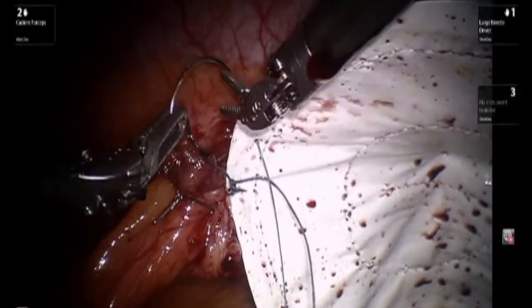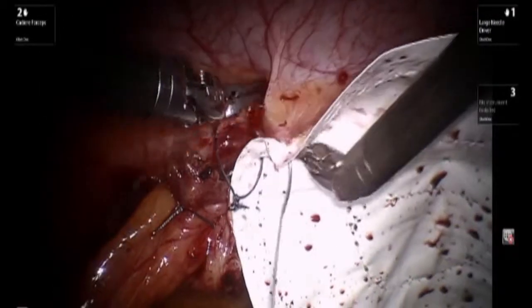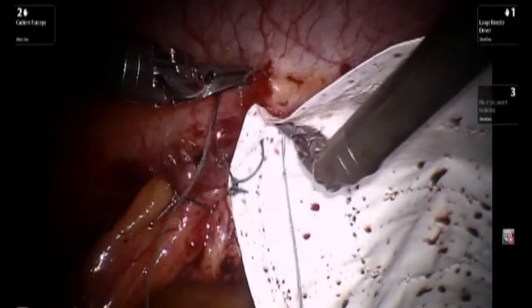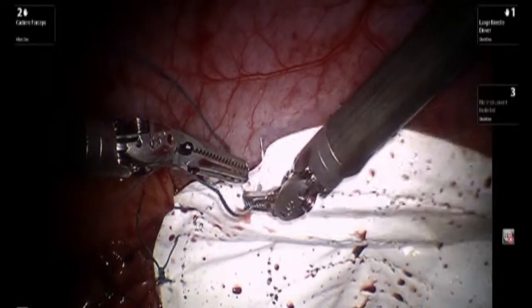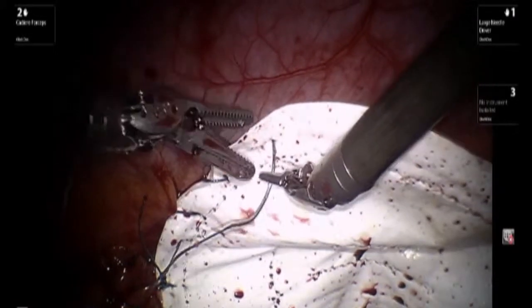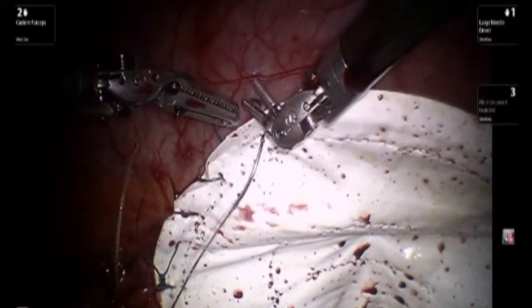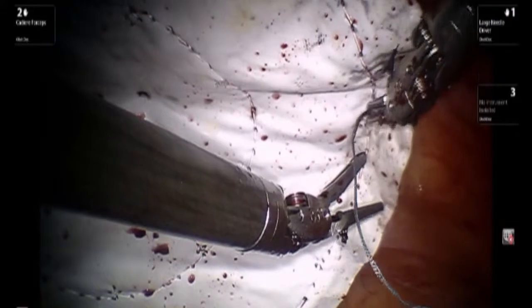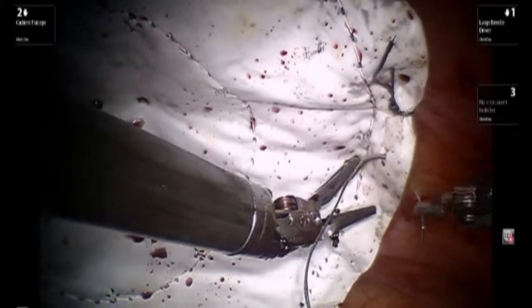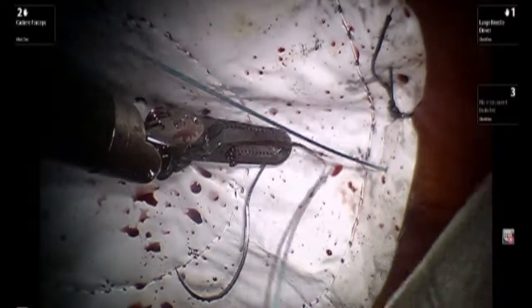As the suturing begins, we progressively place the suture first through the mesh and then through the interior abdominal wall. Ideally one should pay attention to ensure that the sutures are placed approximately equidistant from one another. Once the first half of the mesh is sutured to the wall, we then concentrate on the second half, which is further away from the camera.